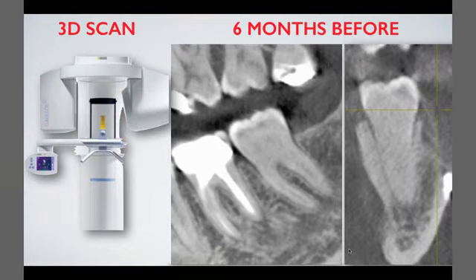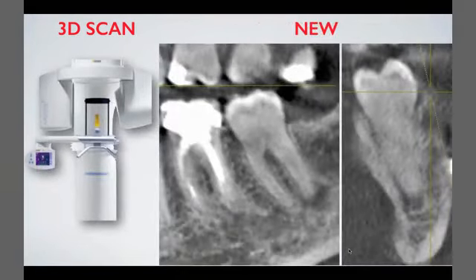I said it's okay. Just go home and let me see you after maybe 1 week, 10 days, and let me see what will happen. So she came back to me after 1 week with very severe pain, complaining from tooth number 7, and she said this tooth hurts a lot. So in the examination, I did another CBCT before starting to see what is happening. And look at this. With the new CBCT, 6 months after the old one, you can see the periapical lesion on the distal root.